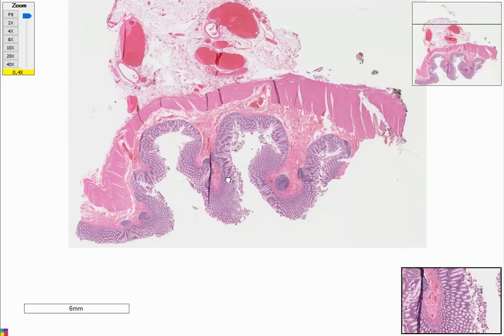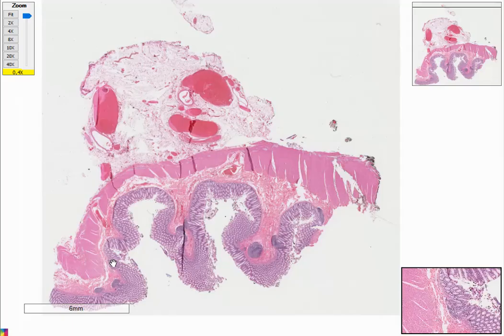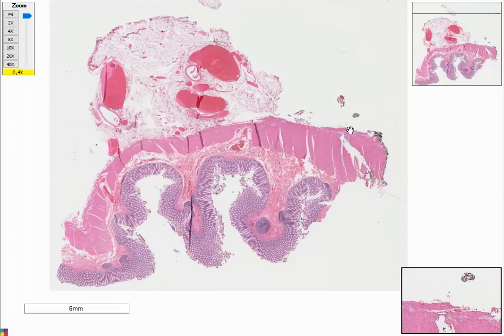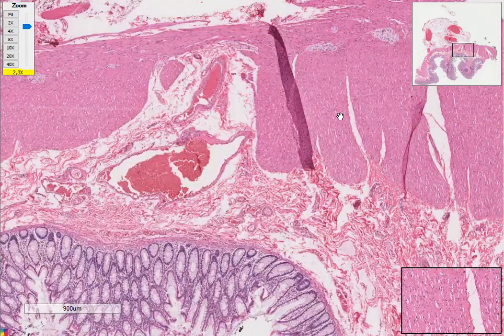There's nothing much here really in terms of normal histology that can throw you off. Just remember, there is also what we call the taenia coli, which are 3 bands of muscular fibers that also help with propelling, and I think here this is one of them which I just showed you.